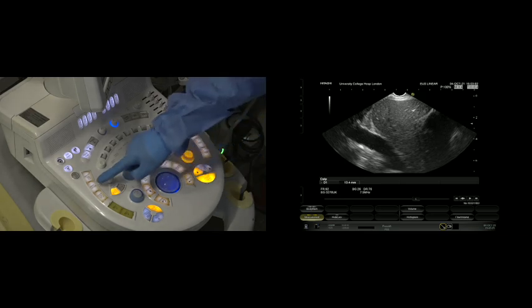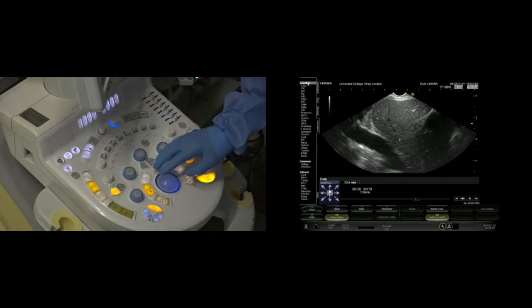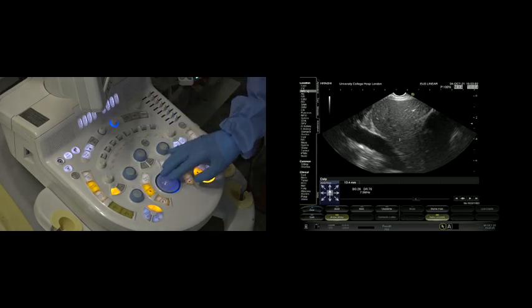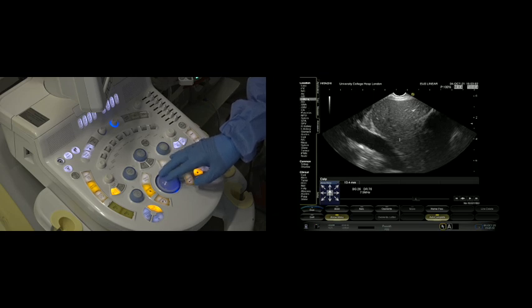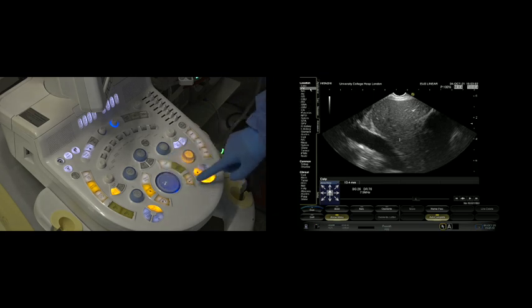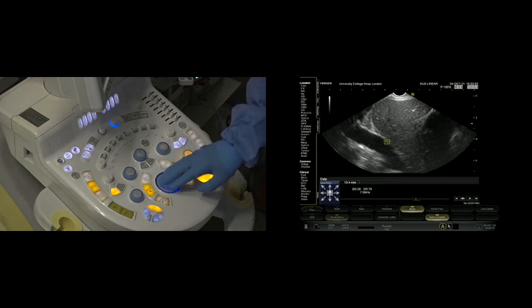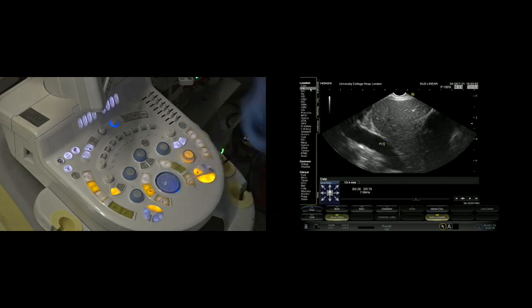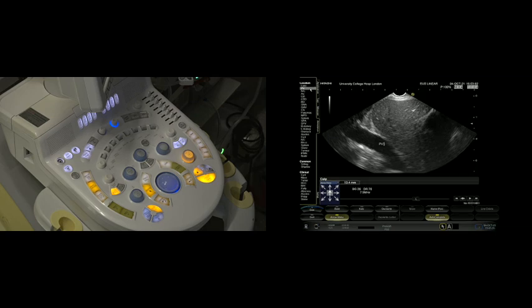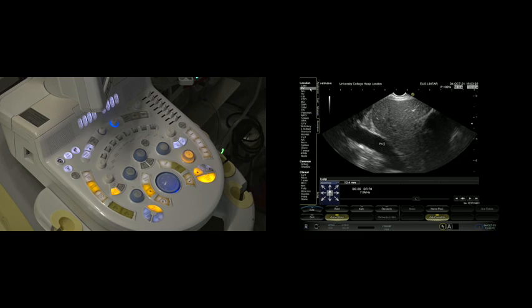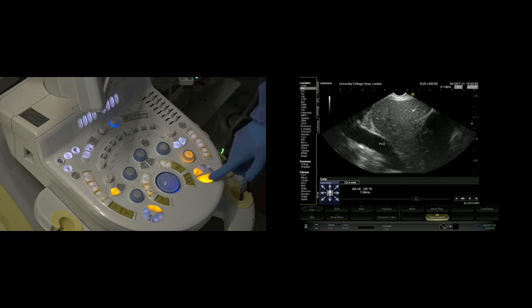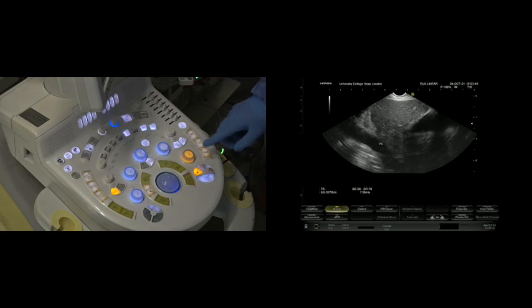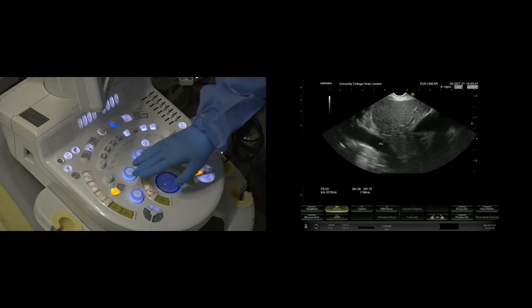The last thing you can do is annotate. You press the button over here, and these are all presets. We're going to go with portal vein, press Enter, stick that on there. That means we can label our images. This should then go into your PACS system in your trust or on the endoscopy report, but very important information medically, legally for our MDTs and decision planning. So that is an intro to knobology.